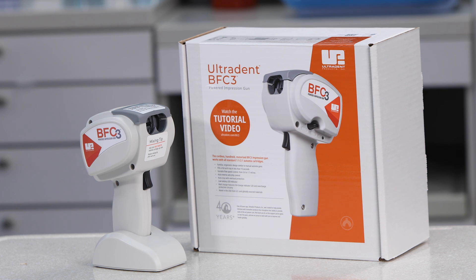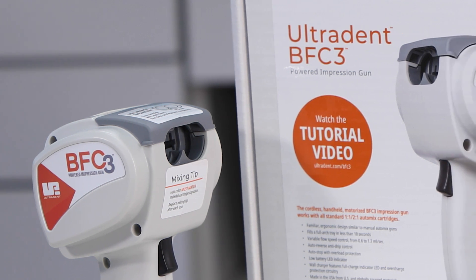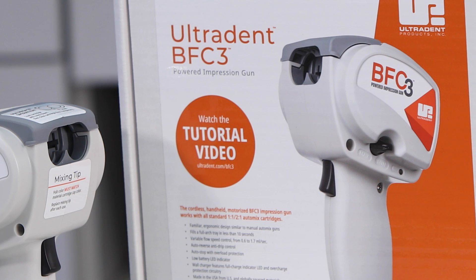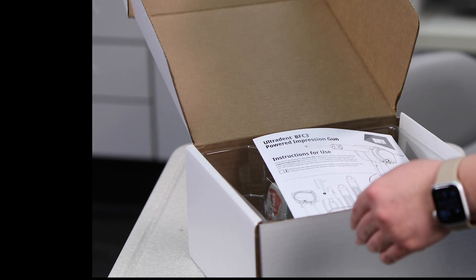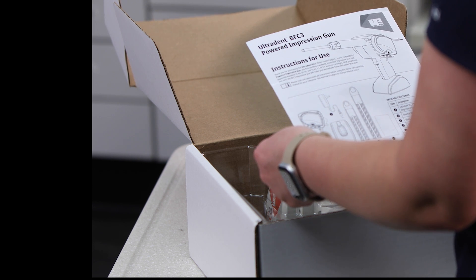Thank you for purchasing the Ultradent BFC3 Impression Gun. With proper use and care, this cordless motorized impression gun will make your procedures faster and easier than ever. Please read the printed materials included with your BFC3 Impression Gun for information on operation and troubleshooting.